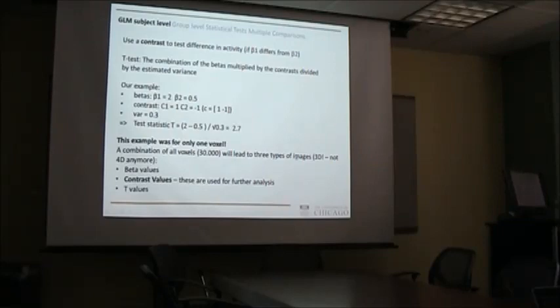And what this basically leads to are 3 types of images, and it's important to always realize that they're 3-dimensional now, not 4-dimensional. The whole pre-processing and raw MRI data has not only the 3 spatial dimensions, but also a 4th time dimension, right?